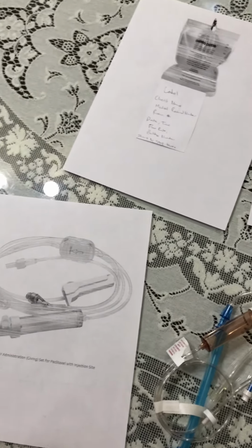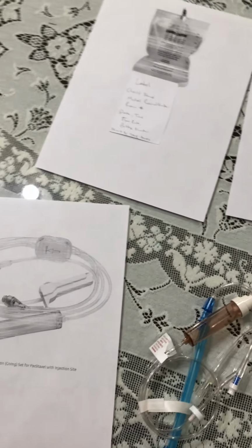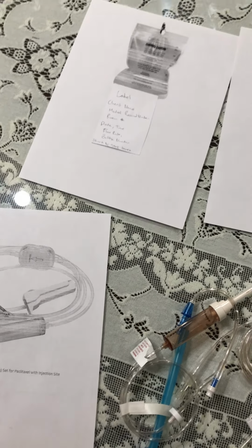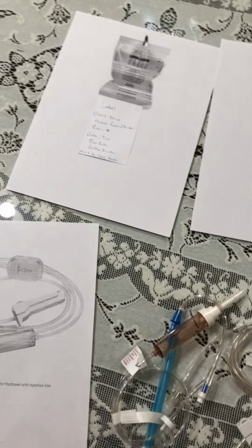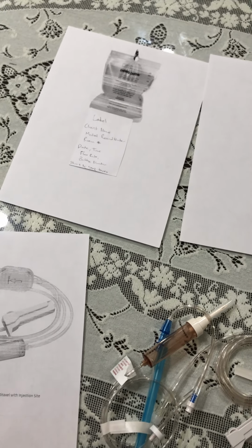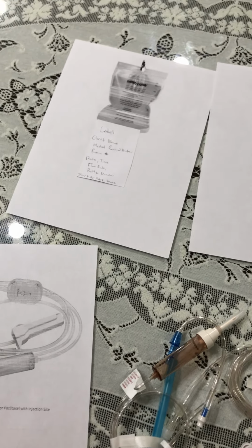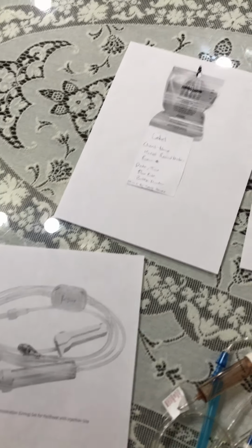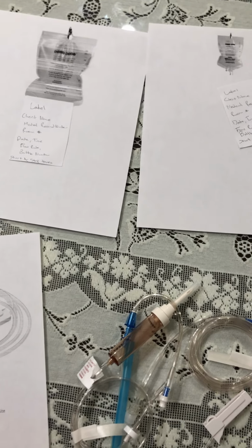I now need to explain the procedure to him. I am going to be giving you TPN and lipids. This is because right now you are not absorbing your nutrients well because you are having some gastrointestinal issues. It's not working right now and you're not absorbing nutrients. So we need to administer this TPN solution and lipid solution into your central access device, and that's going to help you get the nutrients you need.